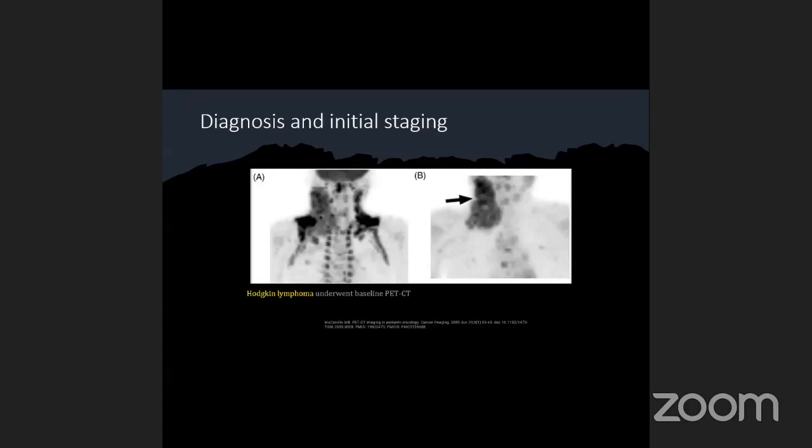Someone just mentioned it, Dr. Assam, I think. So what do you think about this? Which one is lymph nodes? Which one is a mix between lymph node and something else? What is it called? You just mentioned it now. This is called brown fat. Yes, this is the brown fat.